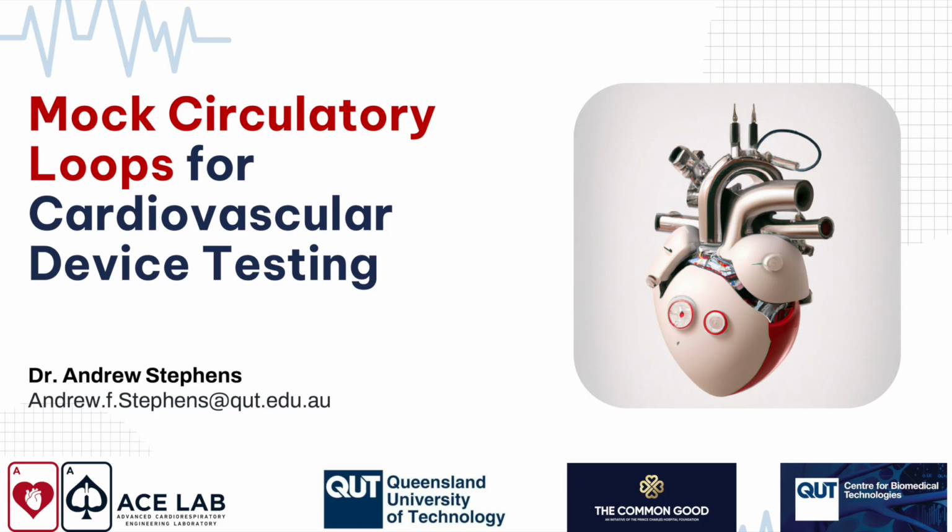In our mock loop, we use a single SVR and a single PVR to lump all of the pulmonary vascular resistance and all of the systemic vascular resistance, so that's arteries and veins for both sides. The easiest way to do that is to use a ball valve or a gate valve or a tap to change the amount of restriction to blood flow.